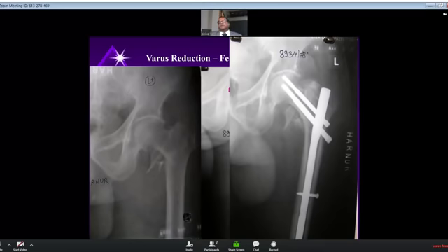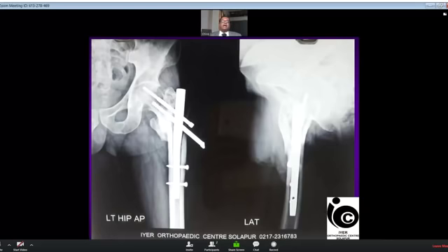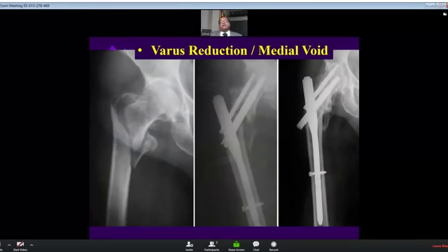Fortunately, the head of the superior screw could not go through the nail and hence it stopped short of entering the joint. Once the fracture healed, I removed this implant since the hip was not damaged and this could be salvaged in this fashion. Another case, a high subtrochanteric fracture, where somebody has inserted the nail at the fracture site without even going through the trochanter. So again, this tilting and shifting of the head has led to the varus and Z effect in turn.